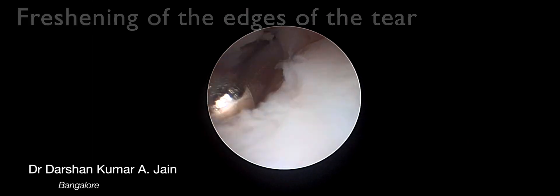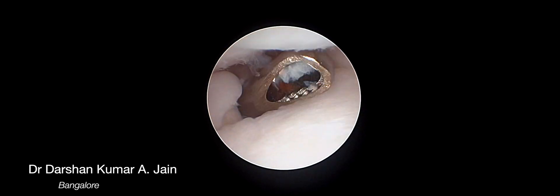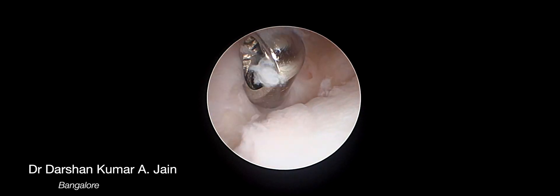A small shaver is introduced, which is around 2.4 millimeters, and the edges of the TFCC are debrided.